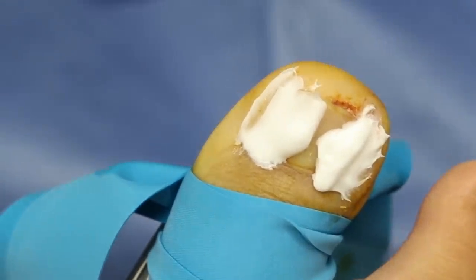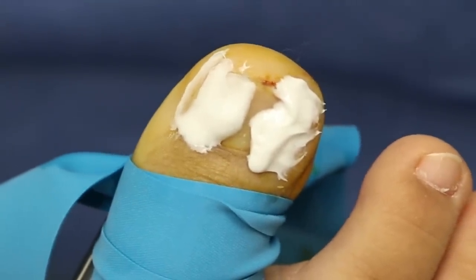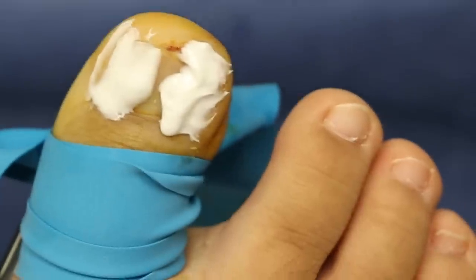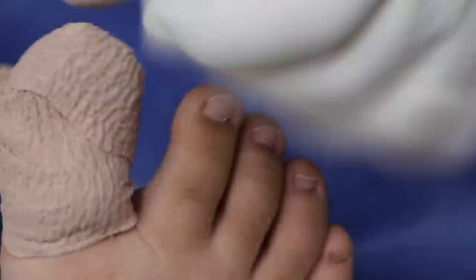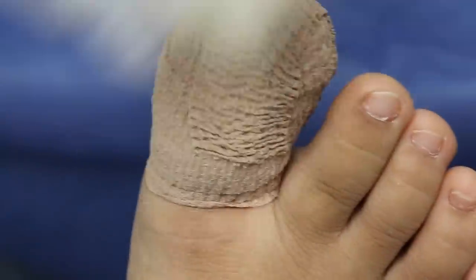This is how you're going to take care of it: put antibiotic cream on either side — that's the whipped cream. If it's not bleeding, which is normal after one to two days, you can just use a band-aid. The first couple of days it's better to put a little gauze because it gives her a little more cushioning and padding. Put on the cream, put on the gauze, and wrap up the toe with this self-adhesive wrap — morning and night. If it's not really bleeding, you can just use the cream and a band-aid. If it bleeds through, just take the bandage off and put a new one on. I'm wrapping it extra the first day just to reduce any bleeding.